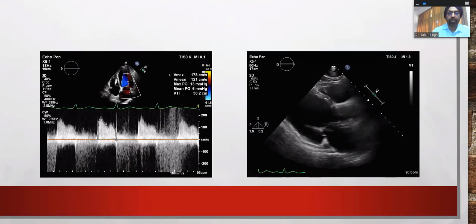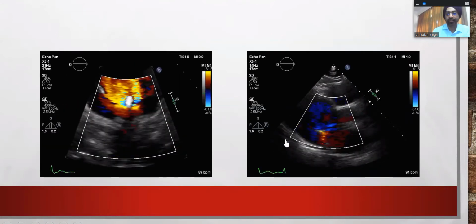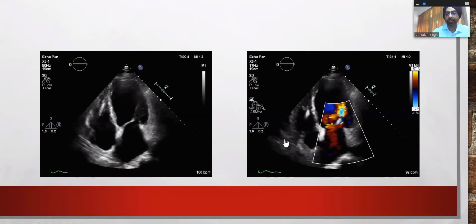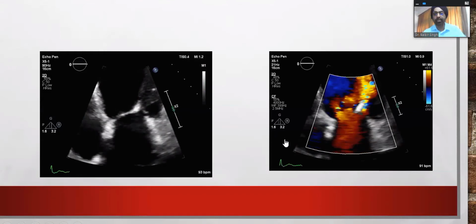But this is the 1 month picture, which shows hardly any MR. So the LV dimensions came down, LV ejection fraction improved 45%. And you see hardly any MR. This is what it is at 1 month. This is the four chamber view, hardly any MR. There is a jet, I agree, but clinically he's asymptomatic now and feeling much, much better.